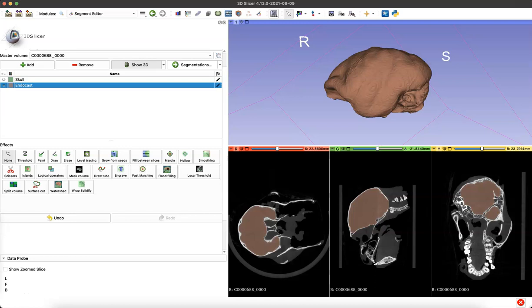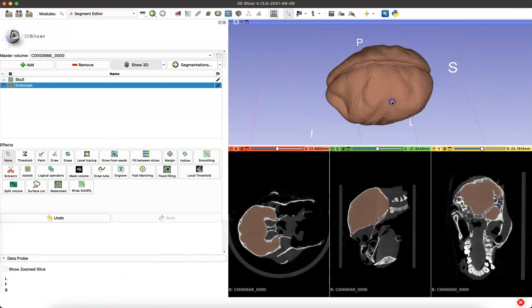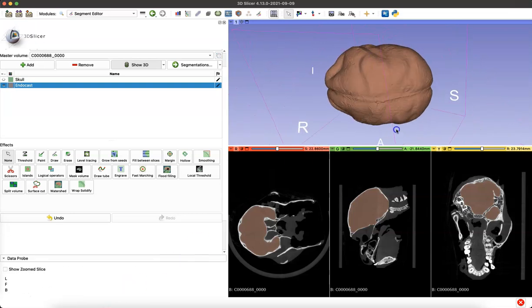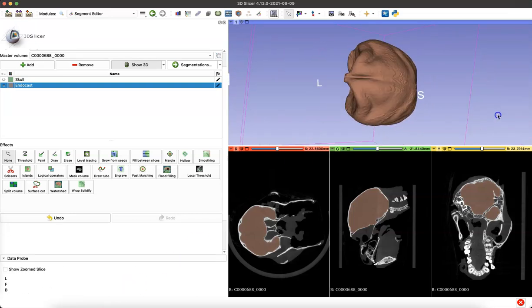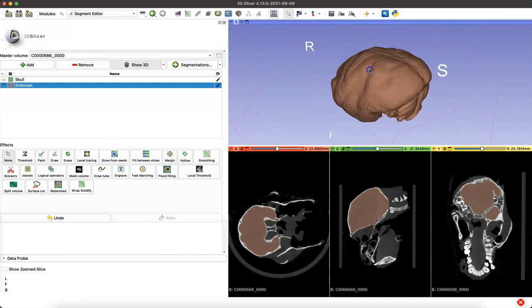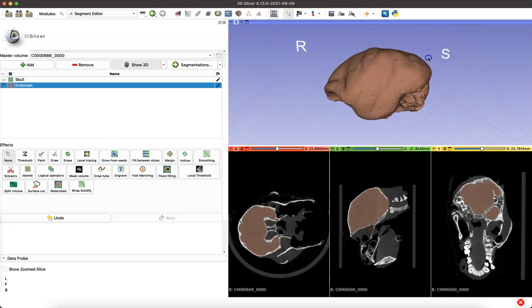As you can see, I've already loaded an endocast into the space, so if you'd like to learn how to do that, see the link in the upper right hand corner. This is representing the brain space within a primate skull. As you can see, I have a primate volume loaded below.